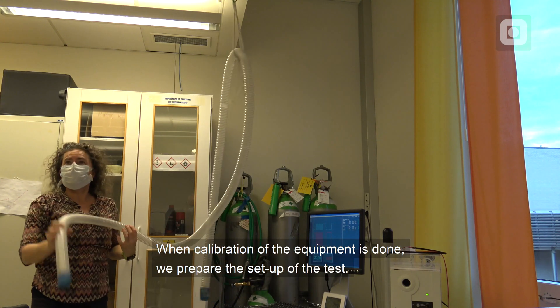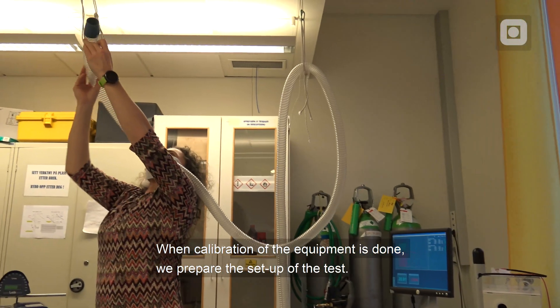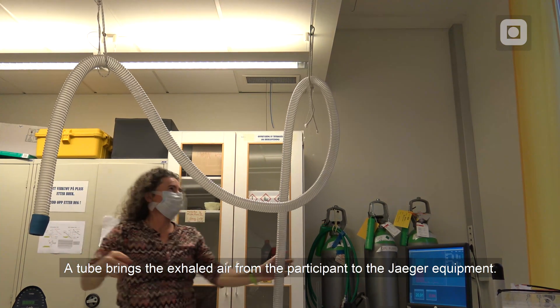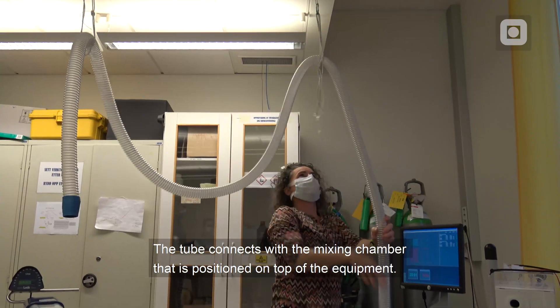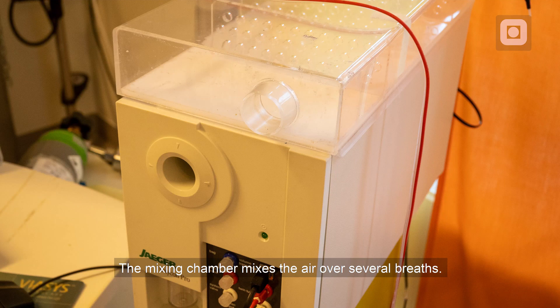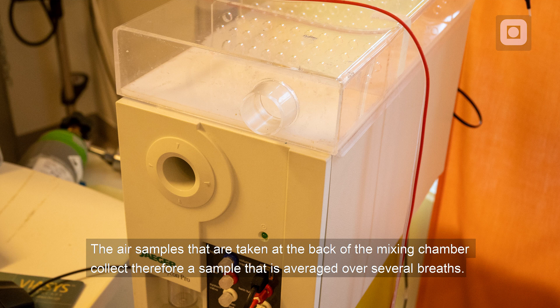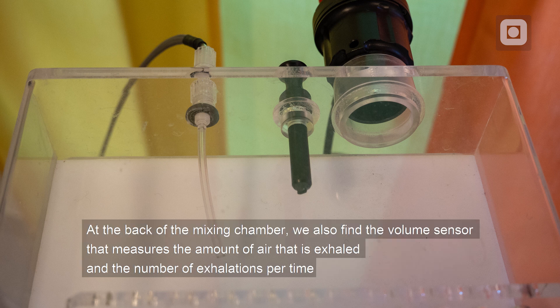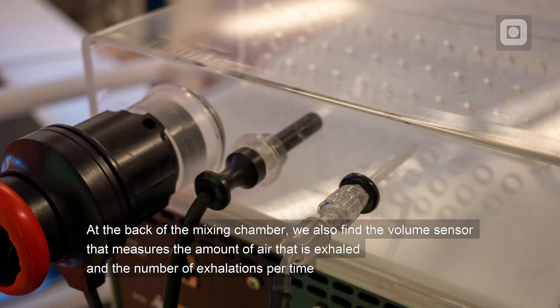When calibration of the equipment is done, we prepare the setup of the test. A tube brings the exhaled air from the participant to the Jäger equipment, connecting with the mixing chamber that is positioned on top of the equipment. The mixing chamber mixes the air over several breaths, so air samples taken at the back of the mixing chamber represent an average over several breaths. At the back of the mixing chamber we also find the volume sensor that measures the amount of air exhaled and the number of exhalations per time.